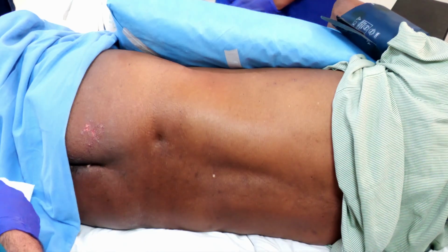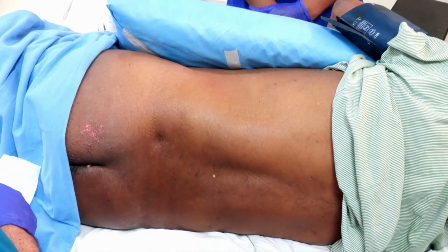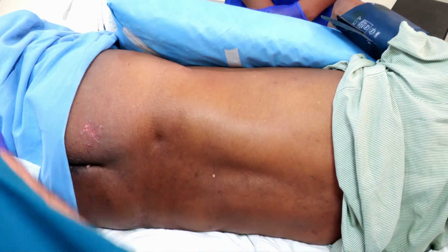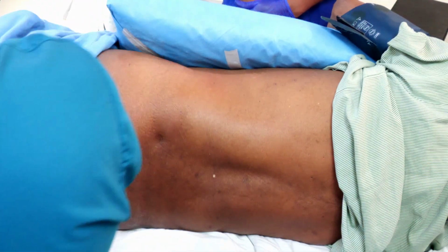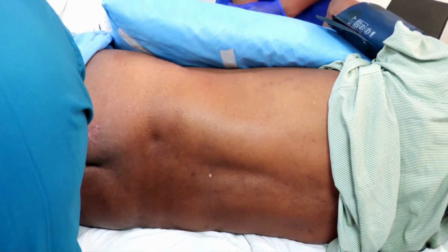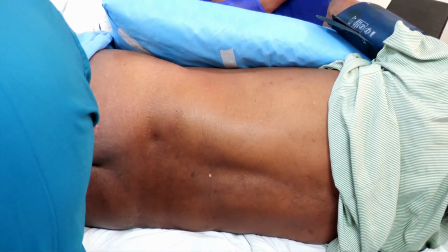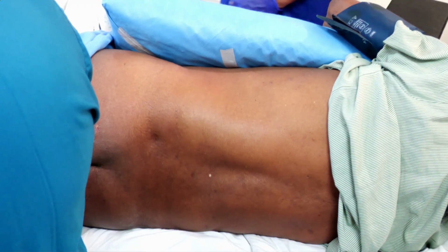That we have is a lumbar sacral plexus block patient. So I'll be handing over the mic to Dr. Jasmeet to give detailed information about the patient. Just that the patient is not a very good patient on clinical grounds. He has multiple comorbidities and an EF finding of 35 to 40%.